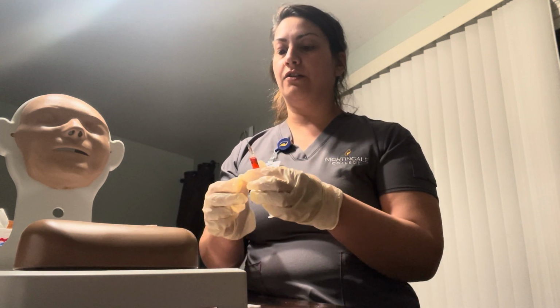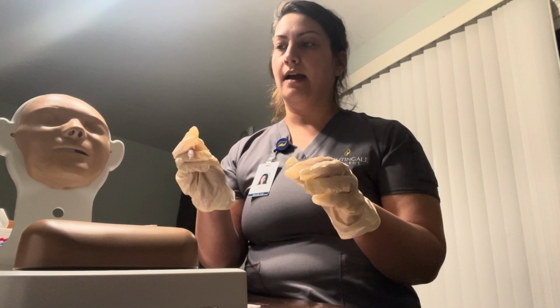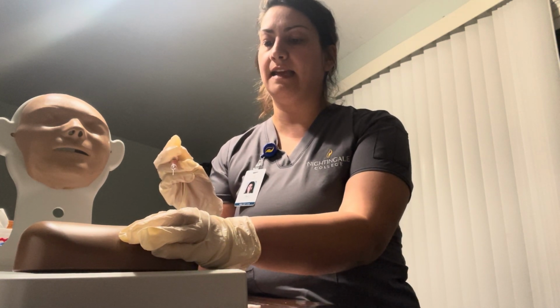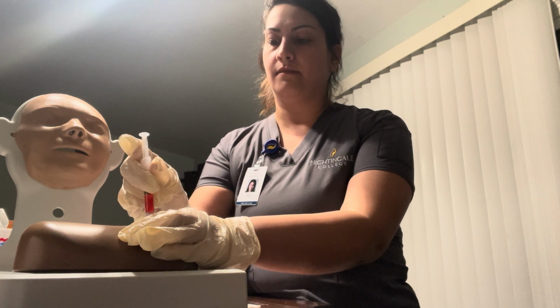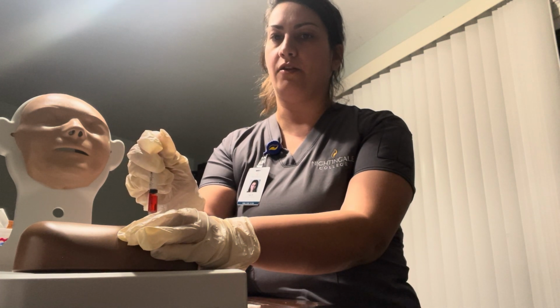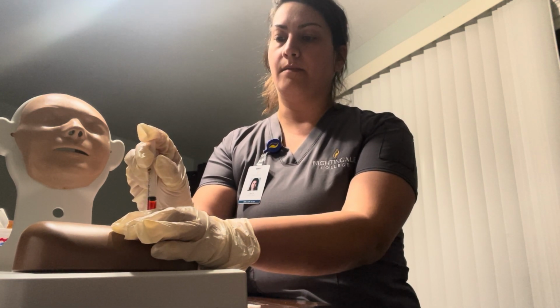And we are going to go at a 90 degree angle, as in a dart, and we are going to make sure that our palms are down. I'm going to grab here for support. I will pull back the skin. I will go in at 90 degrees. I will pull back to make sure that there's no blood coming out, no blood return. Okay, perfect. And I will push in my medication.